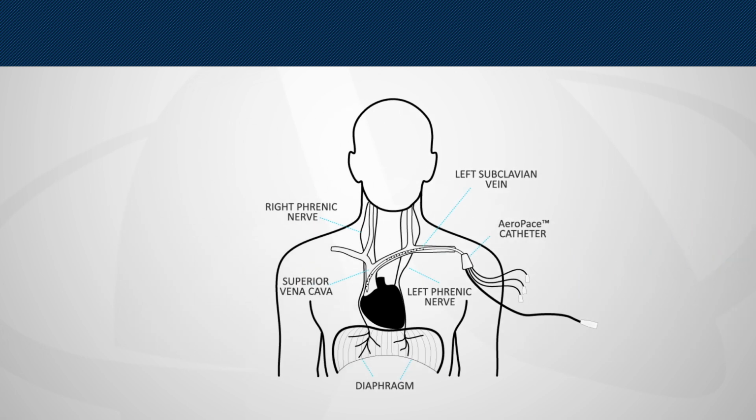The target placement of the catheter tip is in the right side of the mediastinum in the superior vena cava, above its junction with the right atrium and parallel to the lateral wall of the SVC. Its distal tip is positioned at a level above either the azygos vein or the carina of the trachea, whichever is better visualized. After placement, secure the catheter to prevent dislodgement. Use a secondary clamp to secure the catheter as needed.